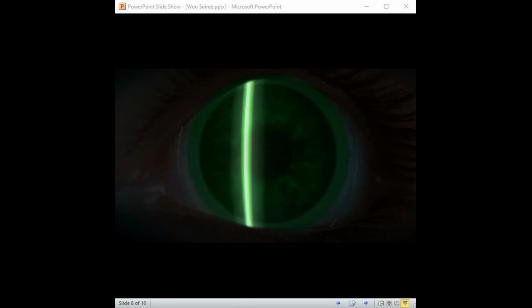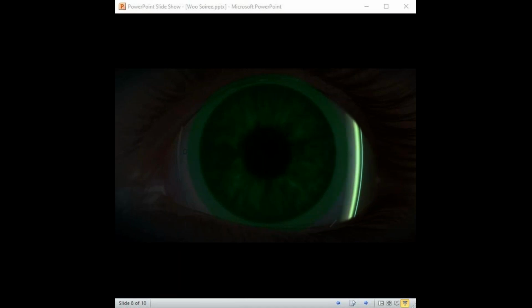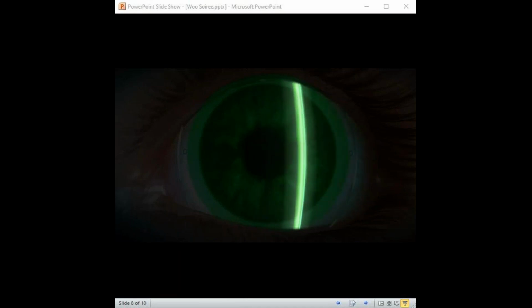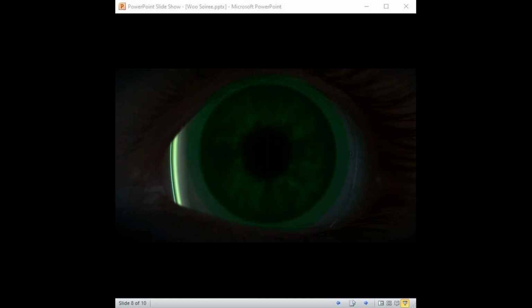The slit lamp can be used to observe the clearance between the cornea and the posterior surface of the lens by performing an optic section. All diagnostic lenses are 0.3 millimeters or 300 microns thick. Use the thickness of the diagnostic lens as a guide to approximate the amount of clearance present. Note the estimated clearance, which can be adjusted if necessary at the time of the patient order.